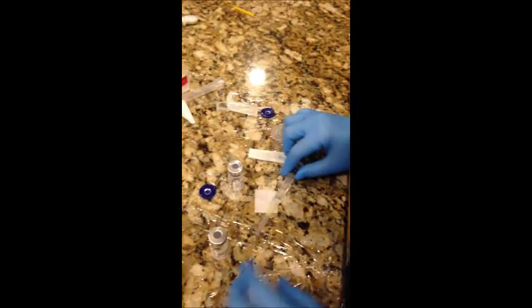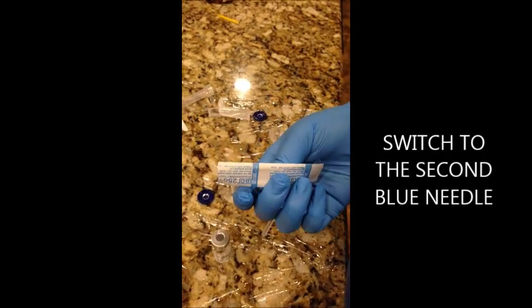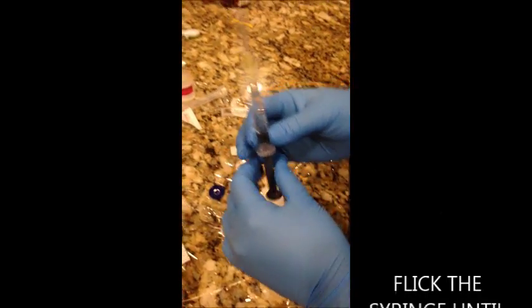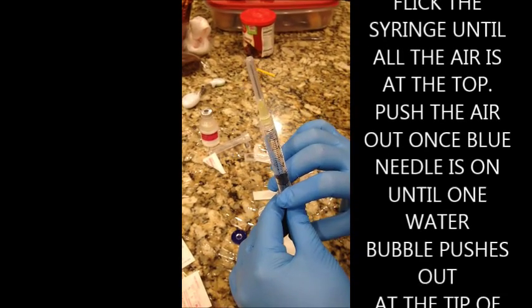Okay, and then you'll just switch to this needle. What you'll do is flick it until you take all the air out.